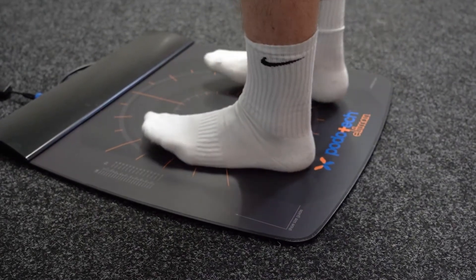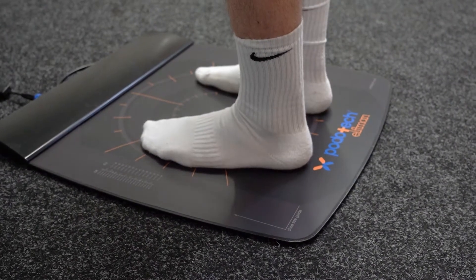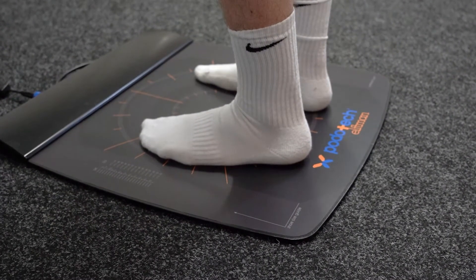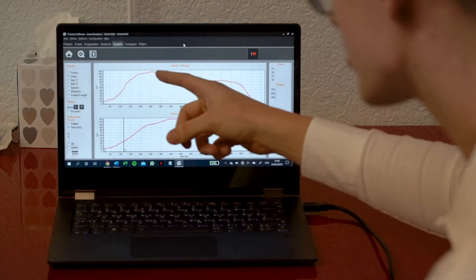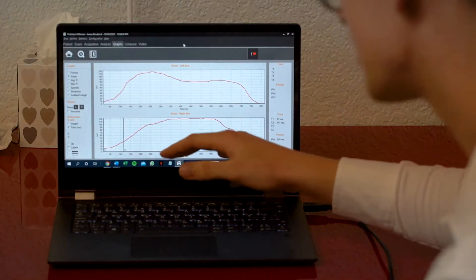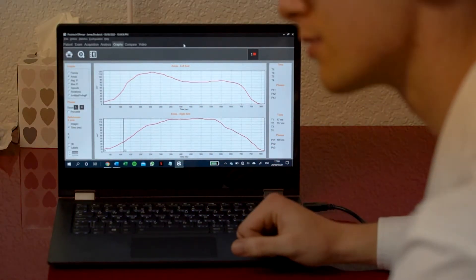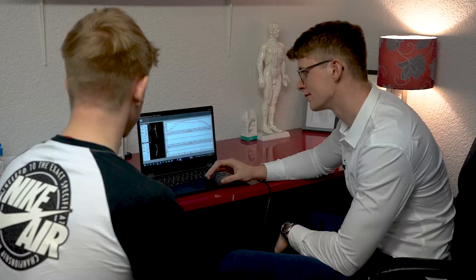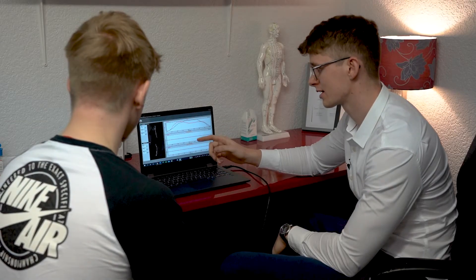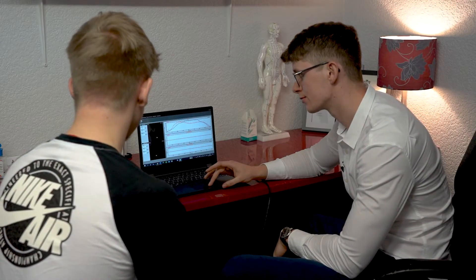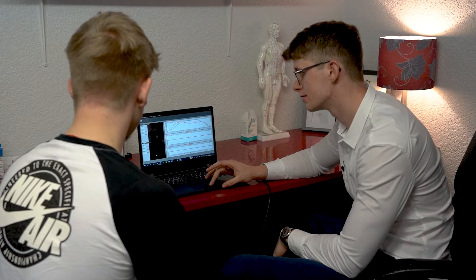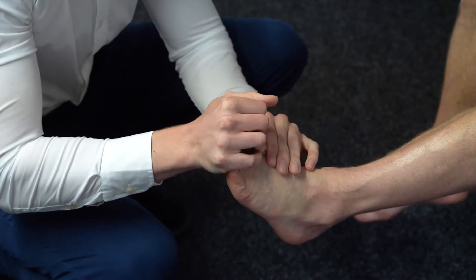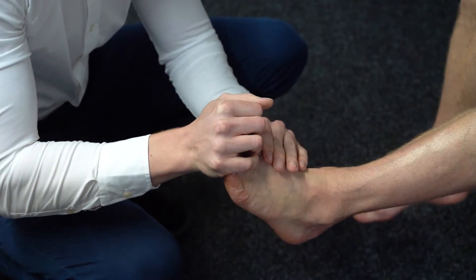Static. Here we can identify pressures under the foot in a static position. During this part of the assessment I will be able to identify anatomical abnormalities such as leg length discrepancies, centre of mass deviations, along with more structural local abnormalities of the foot, such as metatarsal length differences.